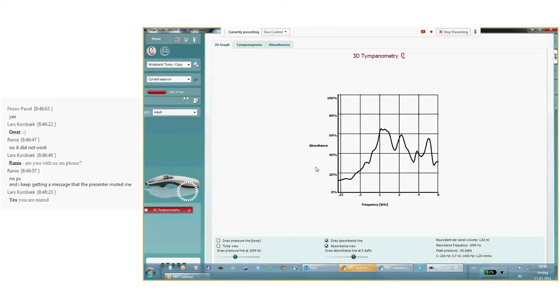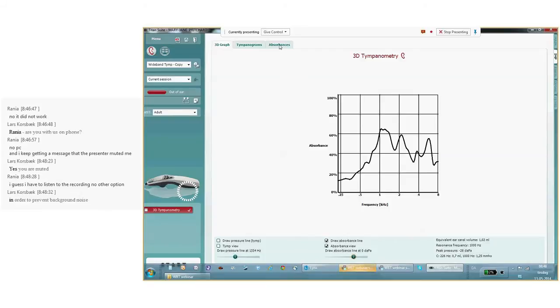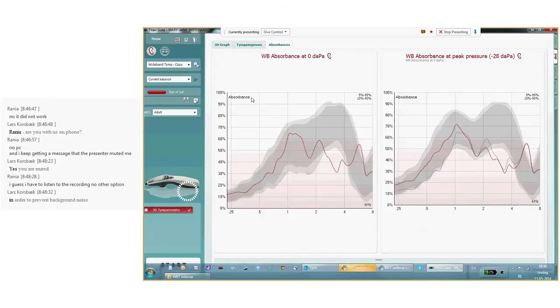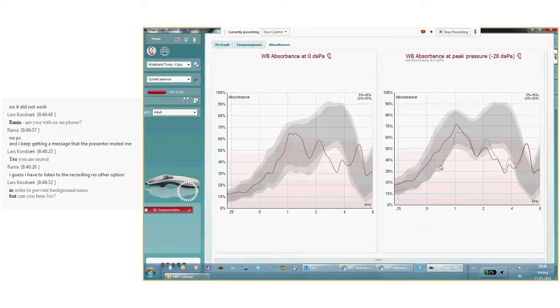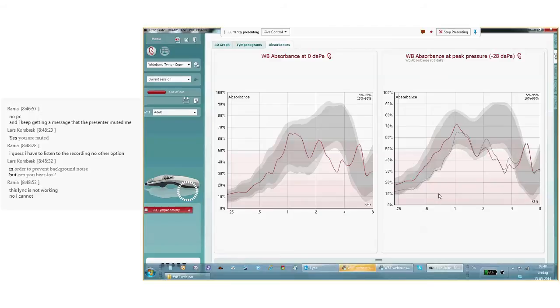Though from this graph you cannot make an interpretation, or it's very difficult to give any meaning to what it is. So we go to the absorbance graphs. In my example, I show two graphs. The left graph shows the absorbance at ambient pressure, and the right graph shows it at peak pressure. The right graph also demonstrates a gray line, which is also the absorbance at ambient pressure. You could do with a single graph, but I thought, just for the explanation, maybe it's nice to see them next to each other as well.